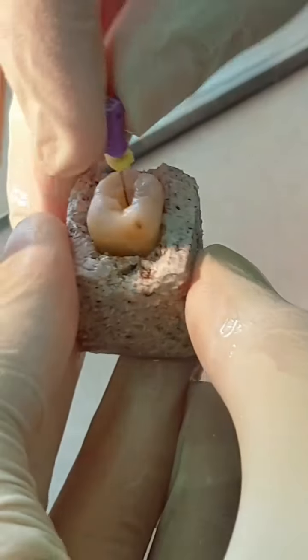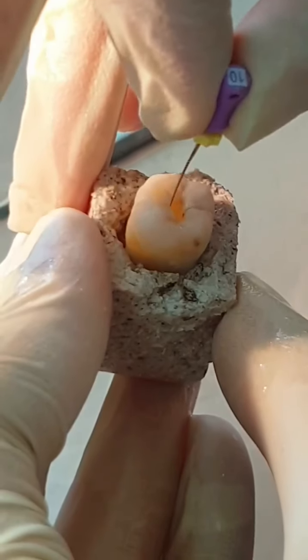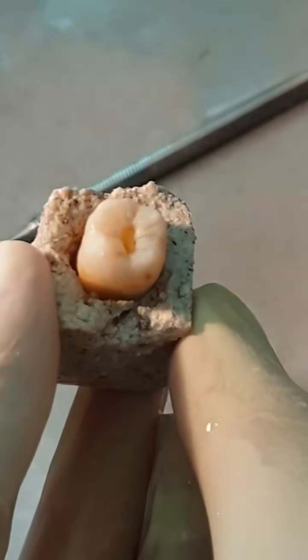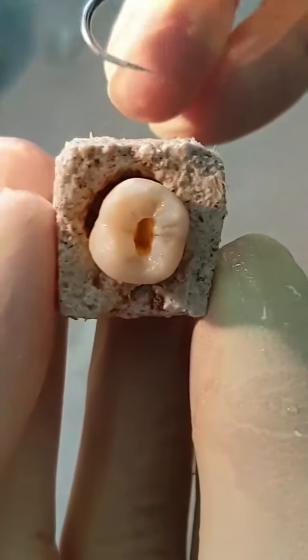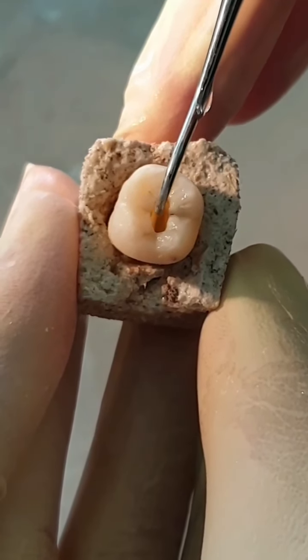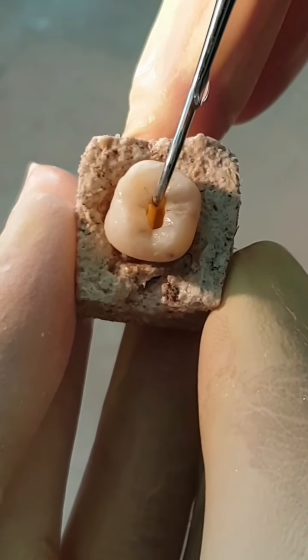As I said earlier, in distal root, some landmarks will help us to figure out how many orifices we have in distal canal. If the location of the orifice is in the center, we usually have 1 canal. As you see, distal canal is just on the developmental groove, and you can see mesiobuccal and mesiolingual orifices too in this case, as I show you now.